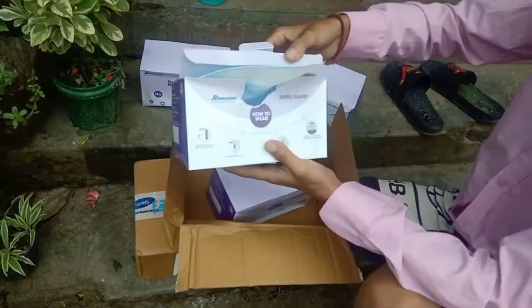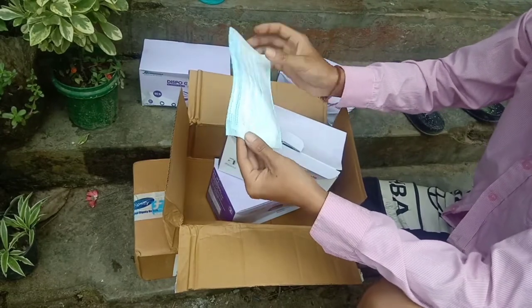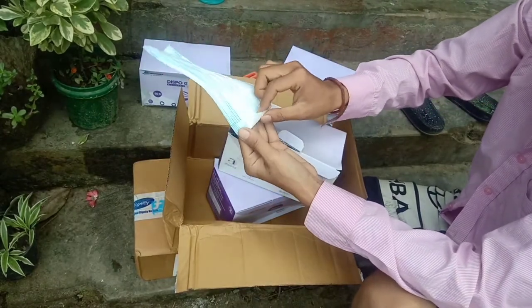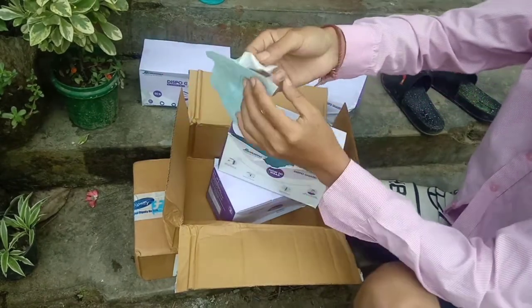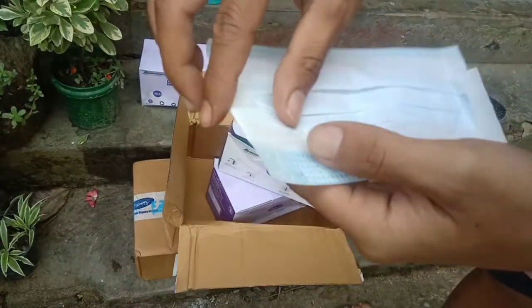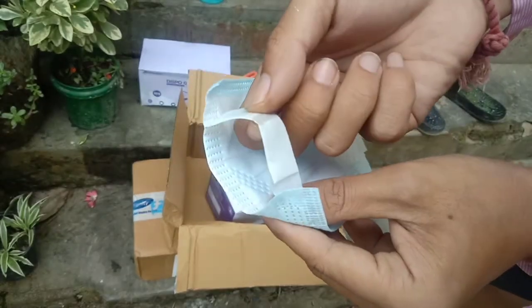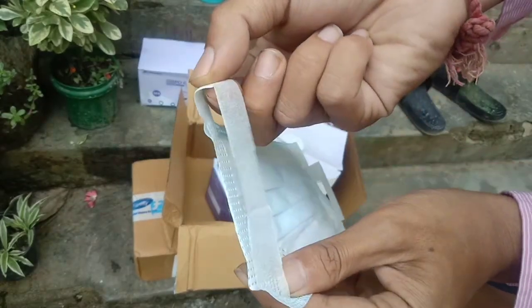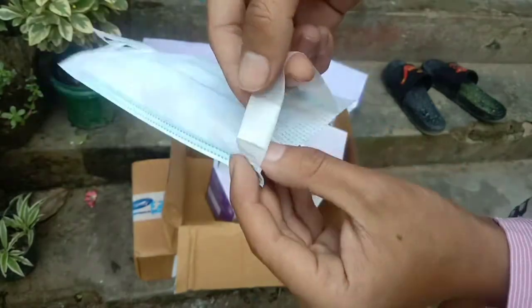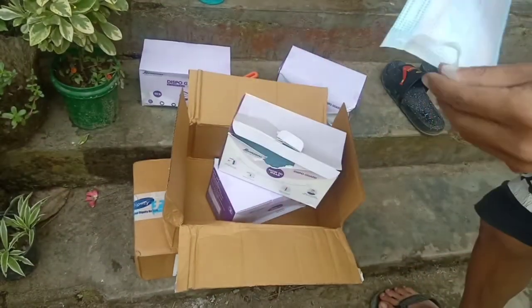I'm going to show you what this mask is all about. I already had this item, so let me show you — it is very, very satisfying to open. These are the ear loops, which are very satisfying to open, as you can see. Wow, so satisfying!